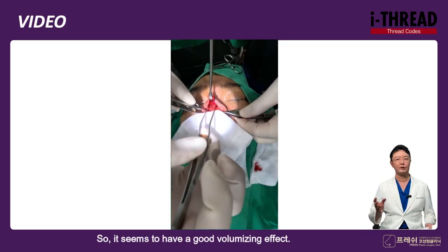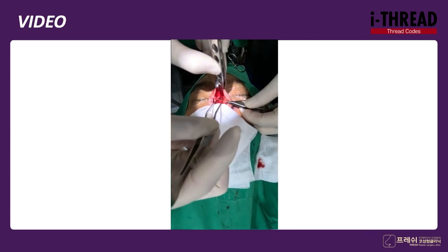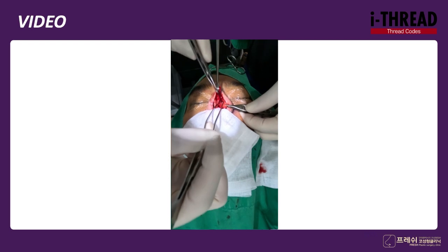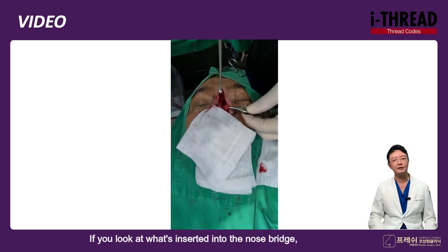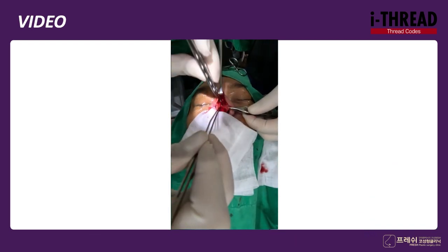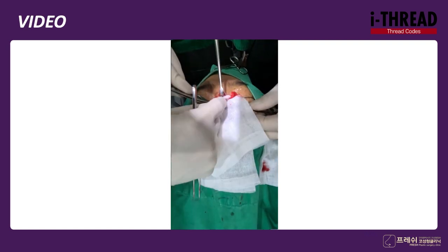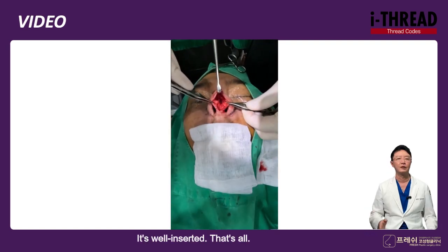So it seems to have a good volumizing effect. If you look at what's inserted into the nose bridge, it's well inserted, that's all.